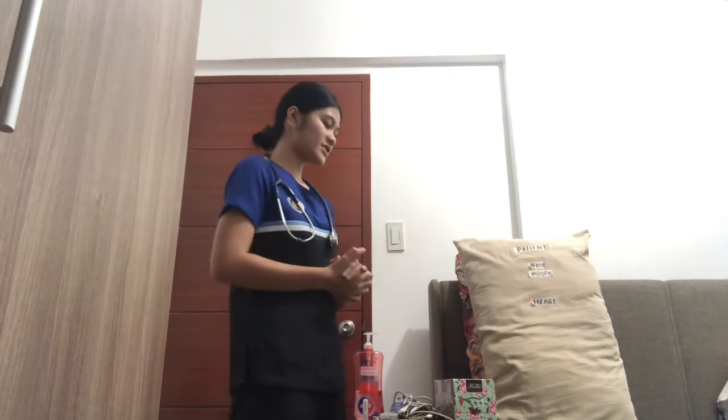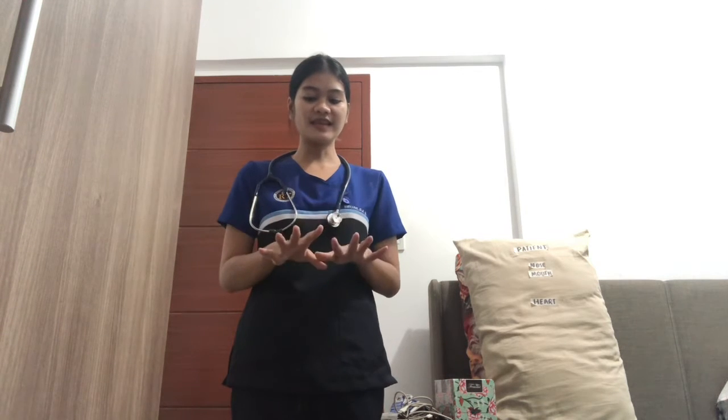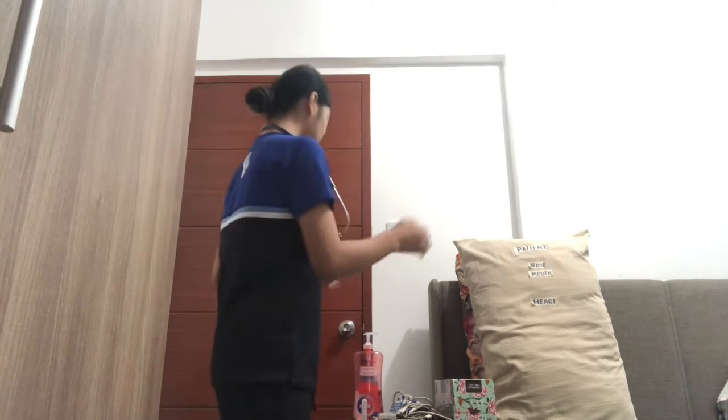So after gathering all the equipments, we will now bring all the equipments to the patient bedside. Then after that, we will provide privacy and do hand washing. By doing hand washing, this is to deter the spread of microorganisms and to avoid infection. Since my hand is somehow clean and spotless, I will just perform a dry hand washing with the use of alcohol.